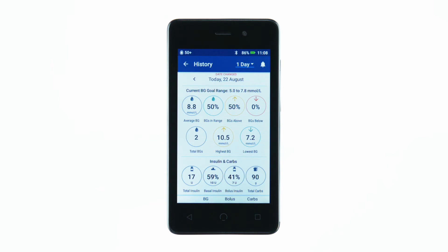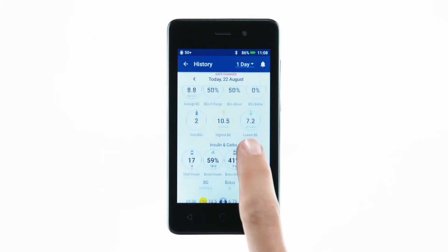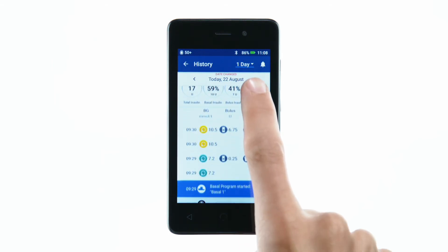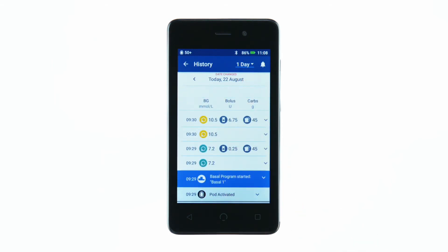The data also includes the time of pod activation and deactivation, any insulin suspensions, and extended bolus details.